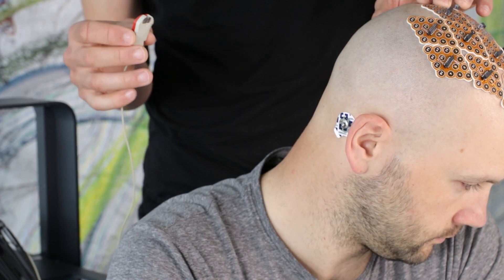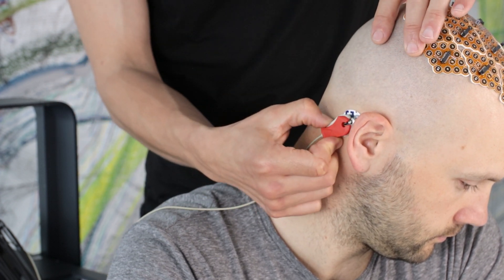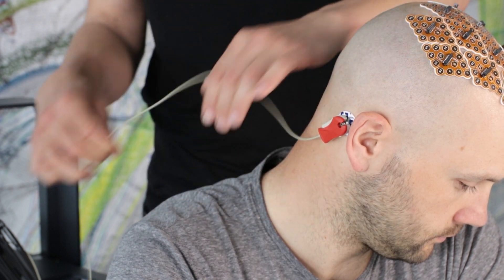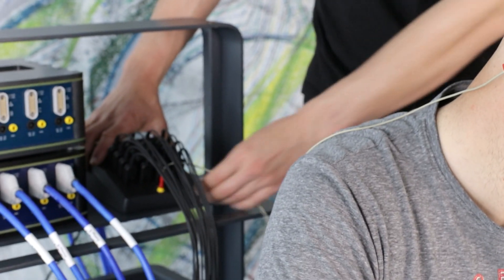As a first step you connect the ground clip to the Mastoid ground electrode. Make sure that the cable is connected to the Pangolin connector box at the ground socket.